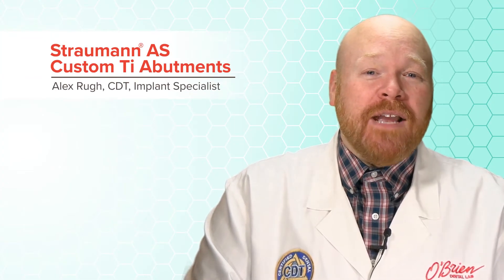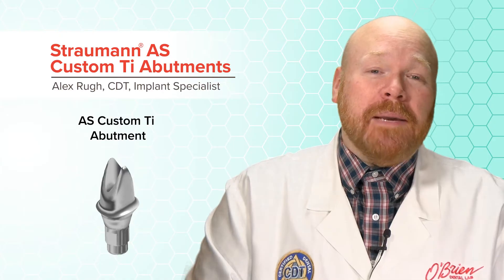Hey everyone, Alex from O'Brien here. This is a quick video to let you know about a new product that we're really excited about. Strauman has just released an angled screw channel custom titanium abutment.